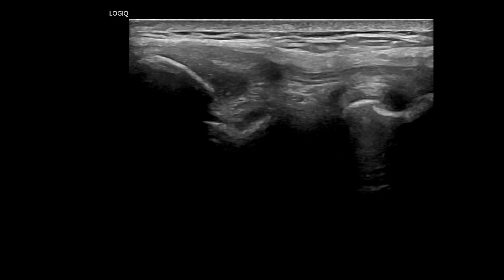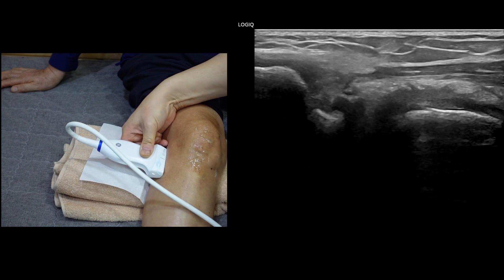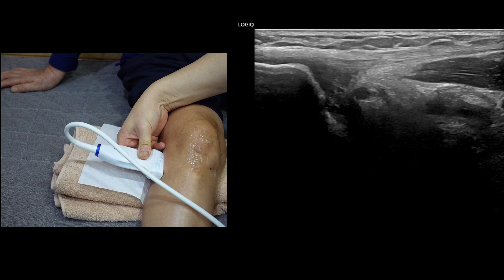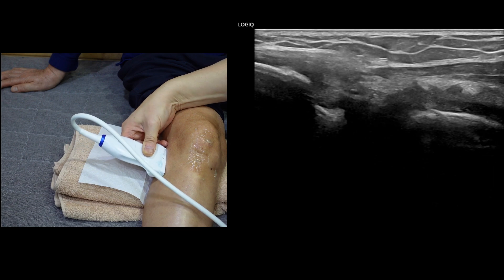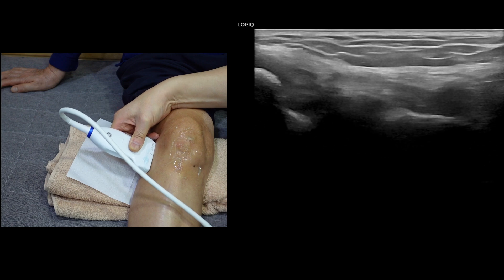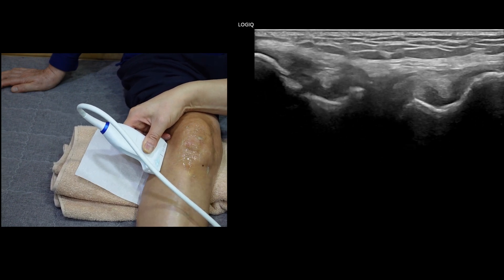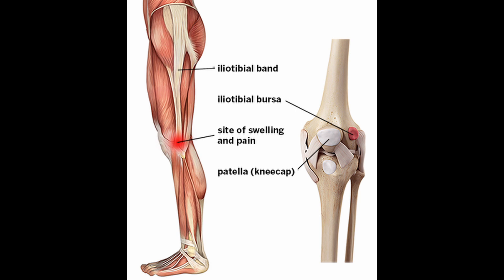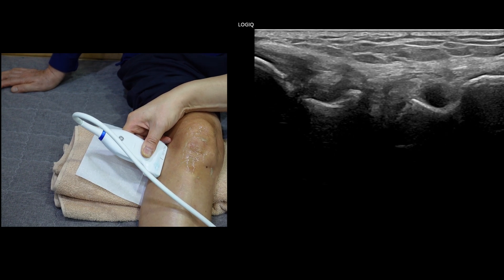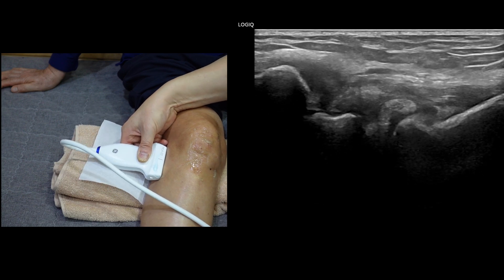While holding the distal aspect of the transducer steady, slide the proximal aspect posteriorly along the biceps femoris tendon to obtain a coronal image. This proximal imaging should include a careful evaluation of the myotendinous junction of the two heads of the biceps femoris muscle, a common site of sports-related tears. Additionally, evaluate the proximal tibiofibular joint for joint effusion and paraarticular ganglia using axial and coronal ultrasound images taken over the anterior aspect of the fibular head. While musculoskeletal specialists commonly consider iliotibial band syndrome for lateral knee pain, I have not found it to be a significant cause. The lateral part of the knee comprises multiple layers, and the lateral meniscus, being deeper than the medial meniscus, presents a lower chance of detecting lateral meniscal tears with ultrasound.